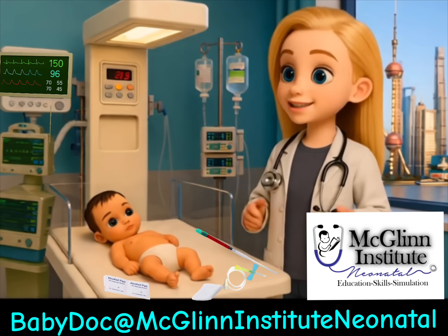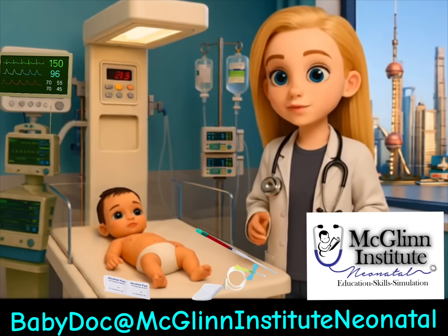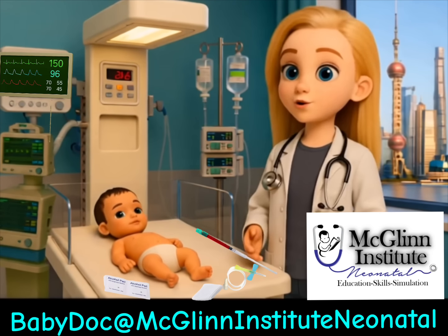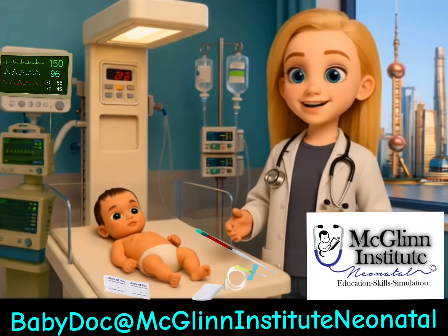2. Gestational age. Preterm infants have different normal ranges than full-term infants, particularly for PCO2, reflecting their immature lung function. Always interpret blood gas results alongside the baby's clinical presentation, overall condition, gestational age, and sample type. I will discuss how to normalize a blood gas in future videos.